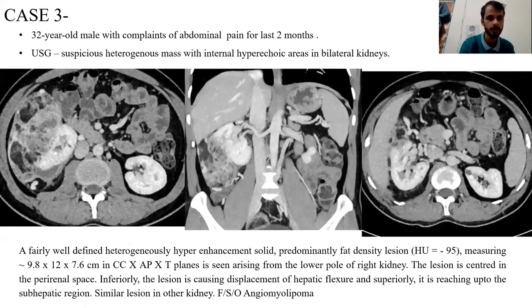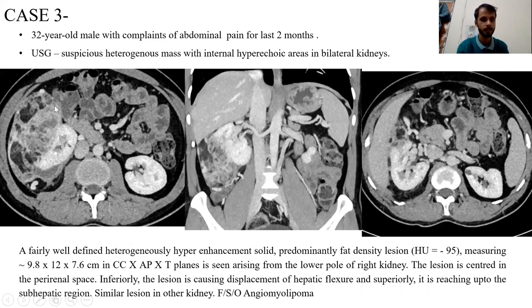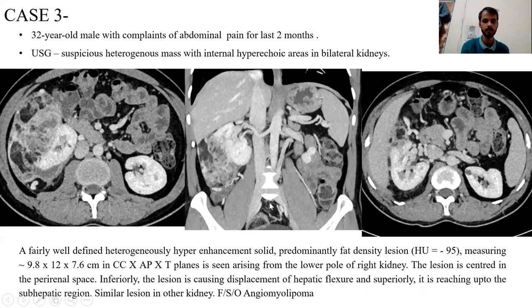Case 3: A 31-year-old male with complaints of abdominal pain for the last two months. Ultrasound showed a heterogeneous mass with internal hyperechoic areas in the right kidney. On axial and coronal CT images of the abdomen, there is a mass arising from the lower pole of the kidney showing internal fat-density areas. The mass is very large but still confined within the perinephric fascia and not extending beyond it. A similar but smaller mass is seen in the other kidney. The mass is displacing the adjacent colon. This is a case of angiomyolipoma.